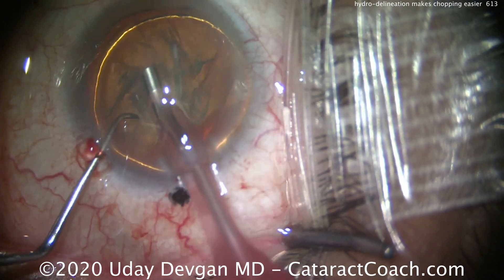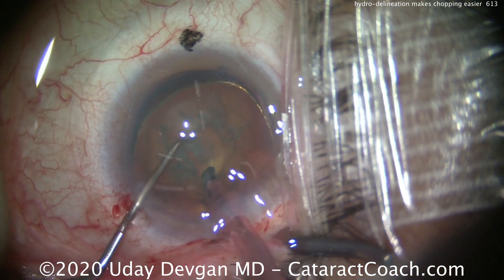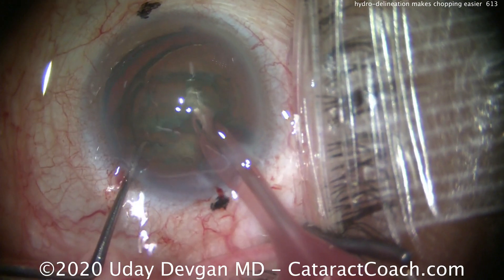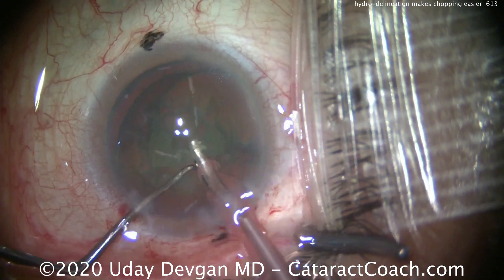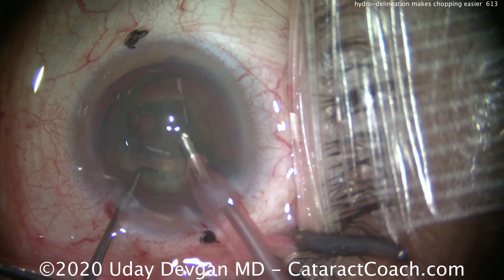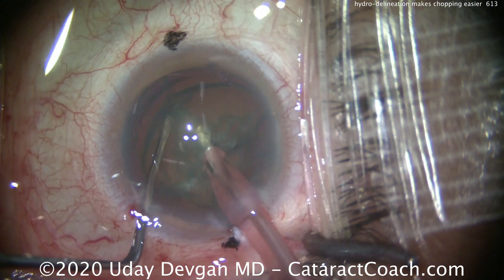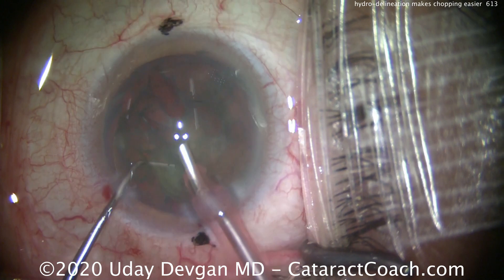So now when we go to do our phaco-chop, we're chopping an endonucleus that's a little bit smaller, and it's a lot easier to maneuver. It's easier to bring it out of the capsular bag opening, because that capsulorrhexis — our anterior opening — is only about 5mm in diameter. By having smaller pieces, a smaller heminucleus, or even smaller quarters, they can come out of that capsular opening very easily.